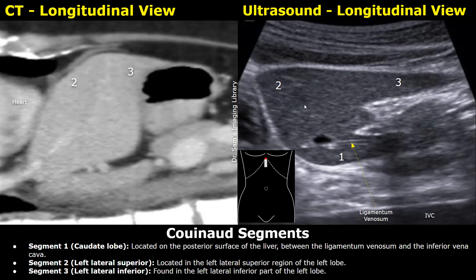These are left lobes of the liver in both the images. In the ultrasound image, when you place the probe just below the sternum in a longitudinal orientation, you get this type of image. When you see the left lobe, the superior aspect of the left lobe which touches the diaphragm is segment 2. The inferior aspect of the left lobe of the liver is segment 3. So segment 2 and segment 3 are segments of the left lobe, visible in longitudinal plane.